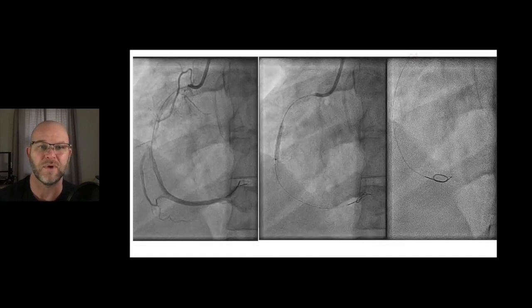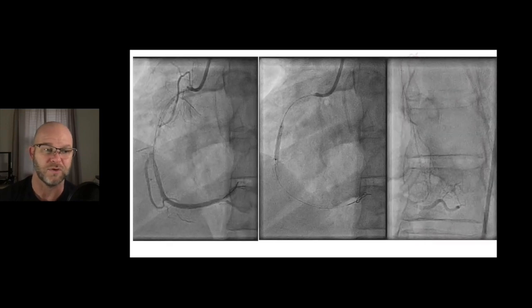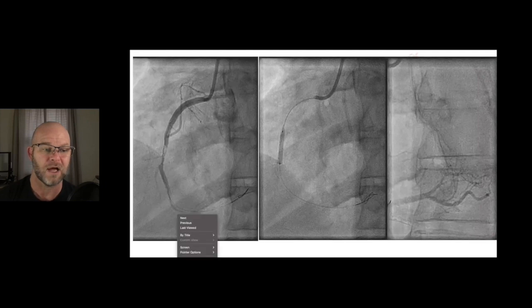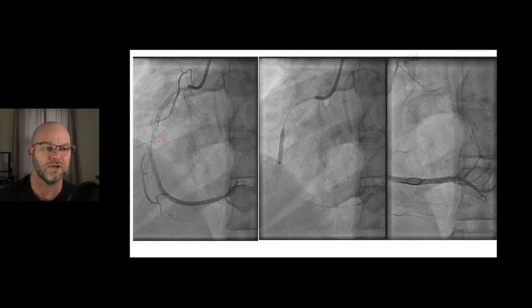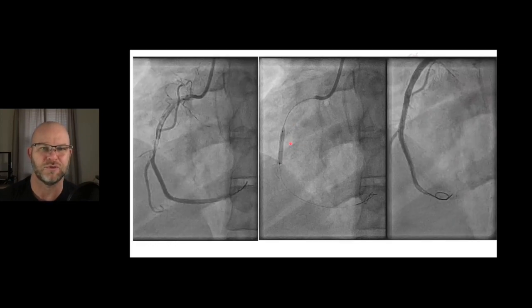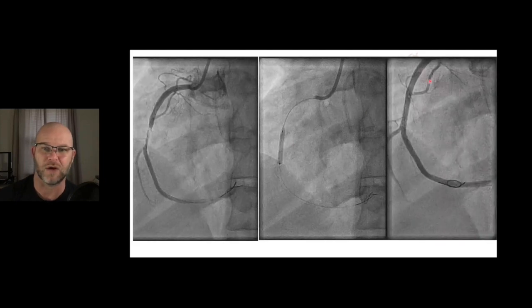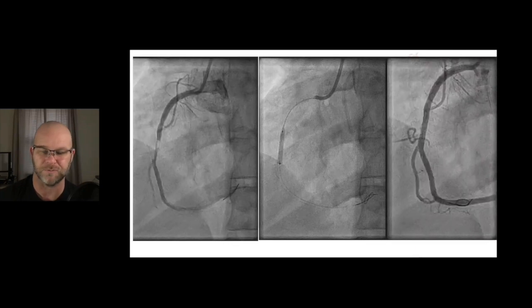This is an example of a left heart cath. This was that previous STEMI that you saw. The first video is a wire going down, and you see that clot in there. That clot, let me get you a little marker here, actually has that gray look to it. So the wire got through. This is a stent being blown up. They just step on the pedal for a minute to record this being done. And then here's that same right coronary artery finished up, and you see how good that actually looks.